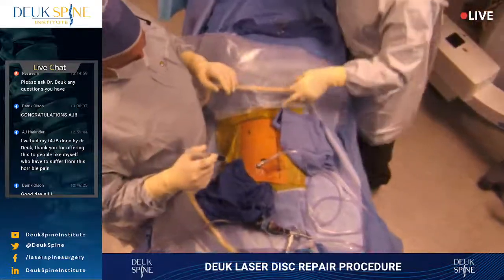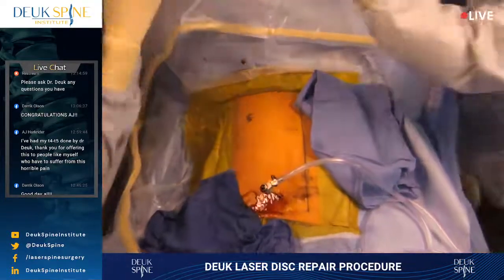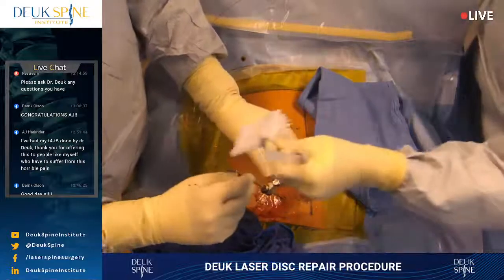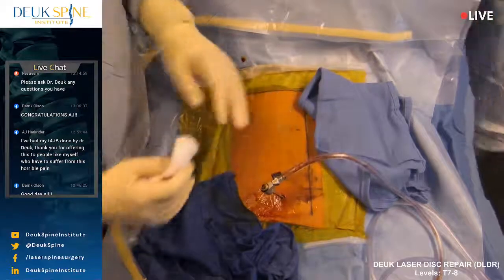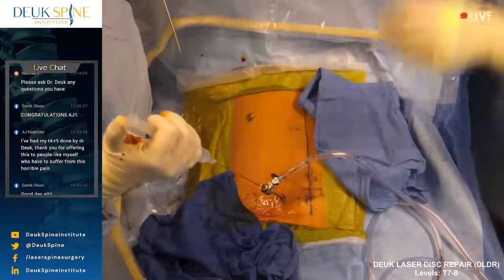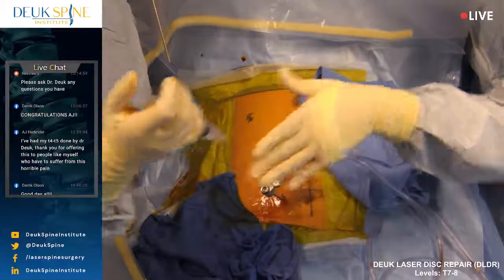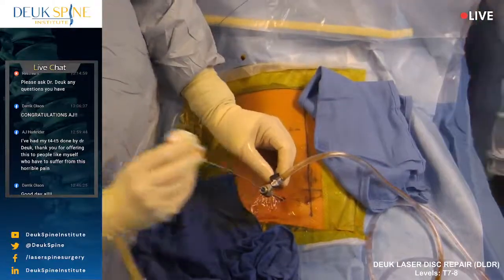We're going to put a little antiseptic called betadine. We've never had an infection with the Deuk laser disc repair. 15 years of surgery, not a single infection. I need the irrigation. Just relax, you're doing great. We're almost done.